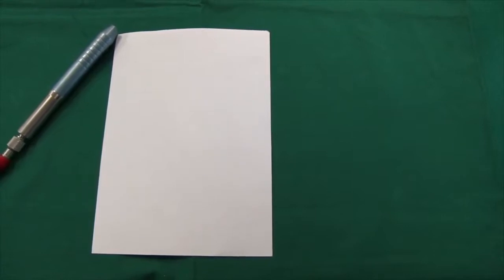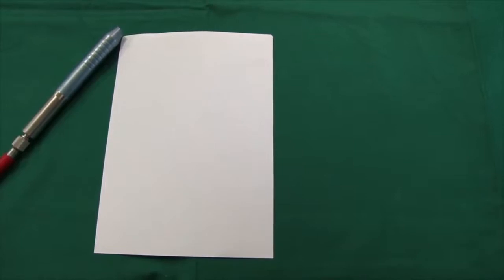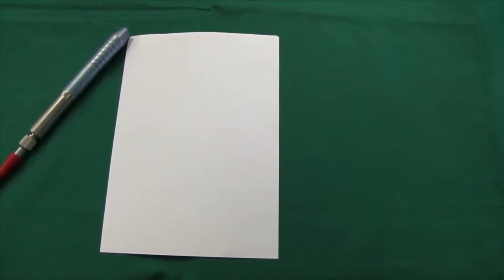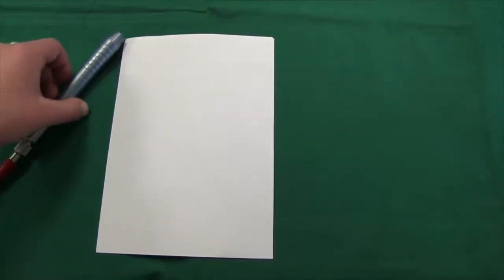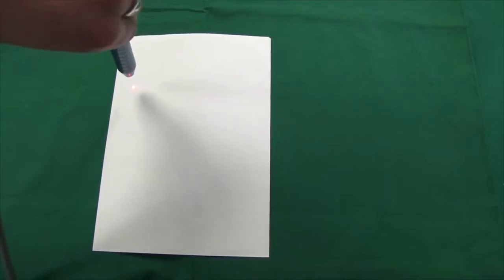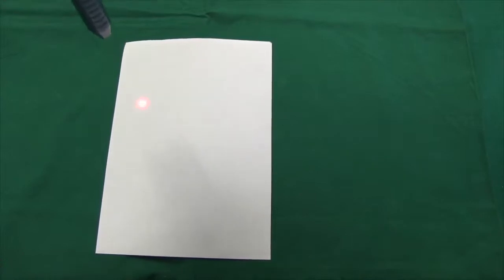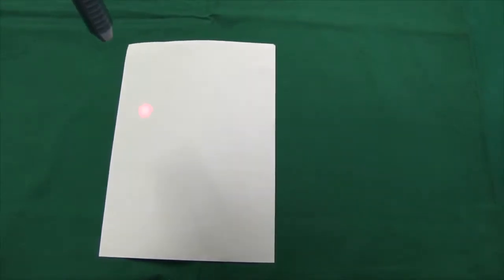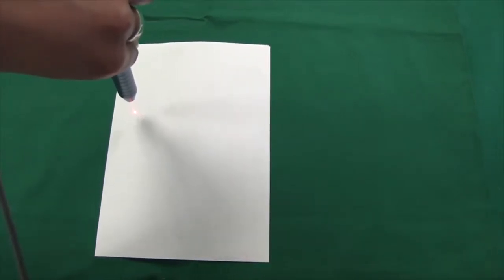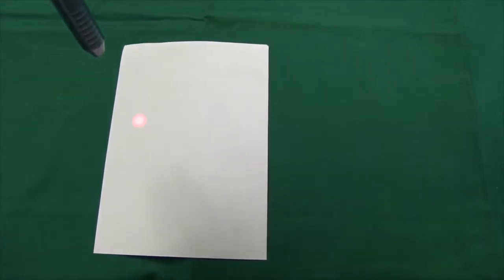Now the shape of the pilot laser spot needs to be investigated. Therefore, the pilot laser light itself has to be checked. Focus the handpiece or the fiber spot onto a bright surface. If the fiber and the handpiece are in flawless condition, the pilot spot is round, brighter in the center and evenly distributed with no visible signs of diffused light on the side or frayed edgings.